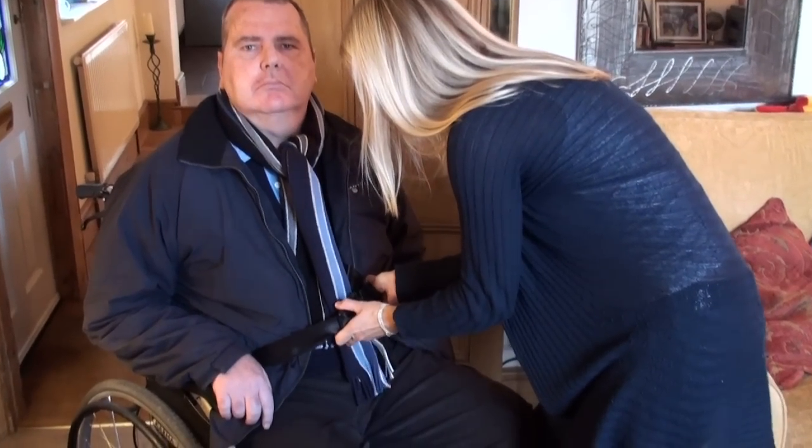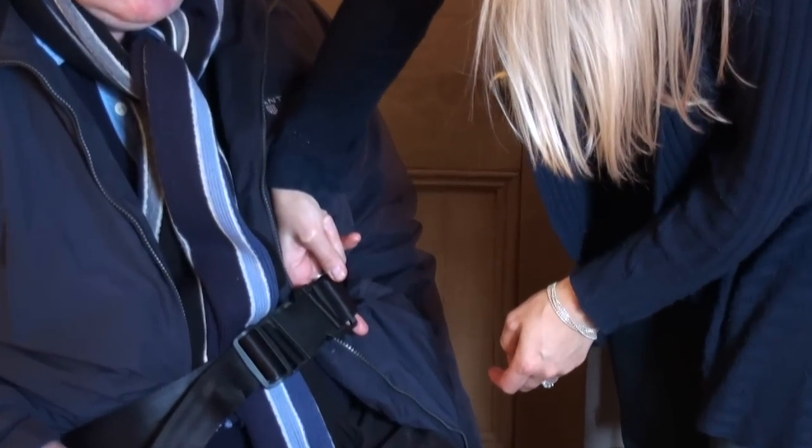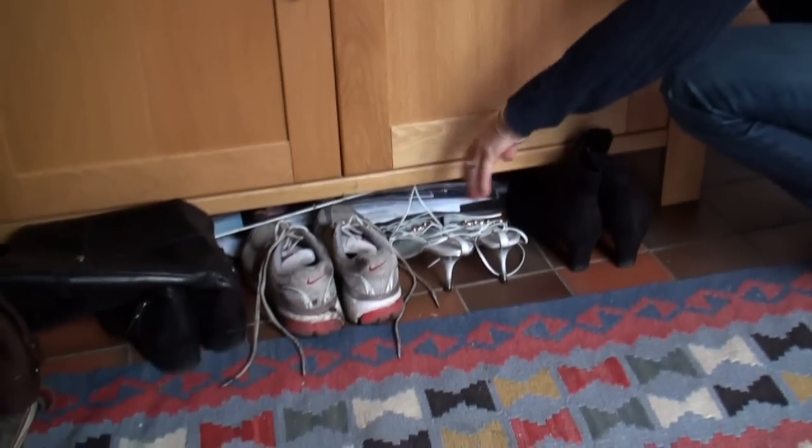Ensure the lap belt is in place and done up — you should allow room for only a couple of fingers. Check the feet are correctly placed on the foot pedals. And when pushing, ensure you have sensible shoes.